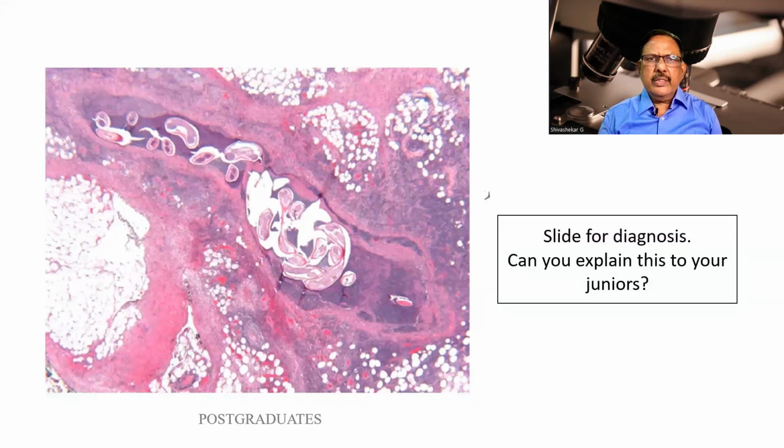This was the slide given to us as homework, a slide for diagnosis, and the condition is, can you explain this to your juniors? Let us see what it is having.